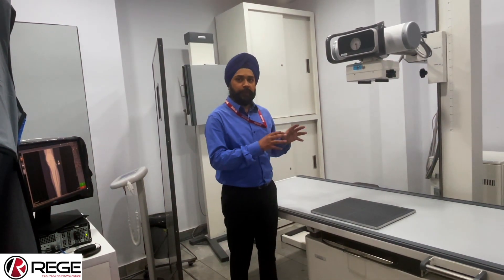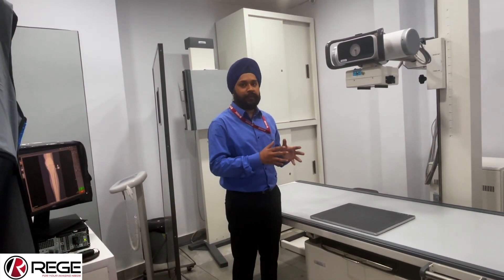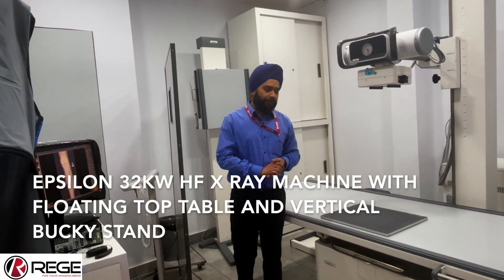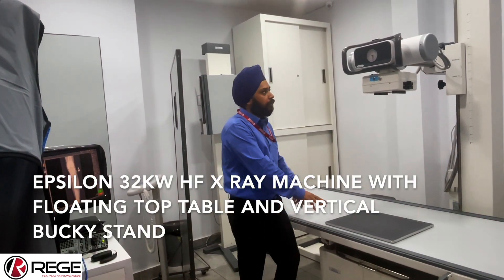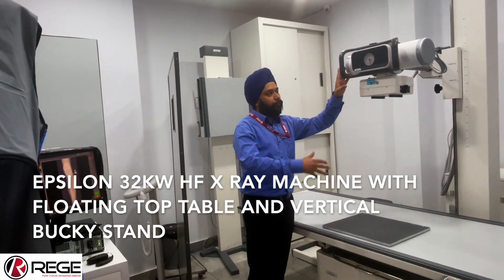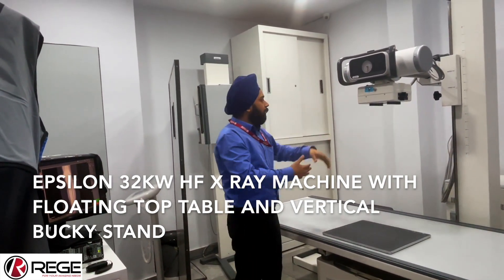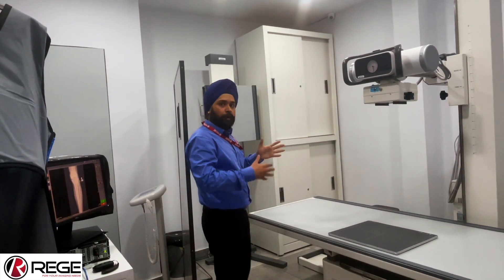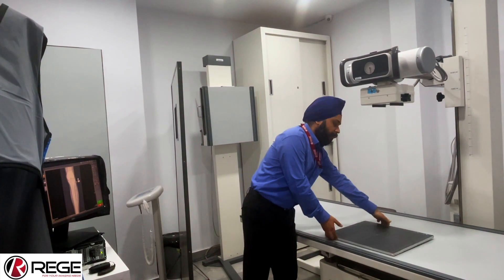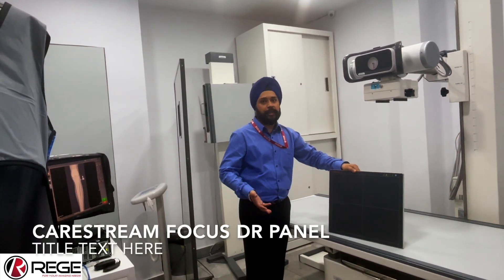Today we will show you a short demonstration of the Epsilon Healthcare 32 kW high frequency fixed X-ray machine. Briefly, this is the X-ray table — a floating top X-ray table. Here we have the X-ray tube which has up, down, right, left as well as telescopic movements. We also have a vertical Bucky stand fitted with magnetic locks, and this is the Carestream detector installed with these machines, which produces amazing image quality.